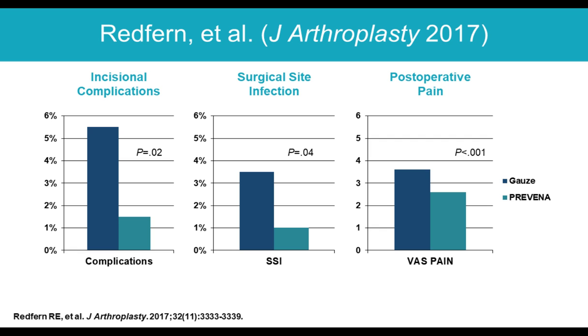And they weren't exactly sure why this happened. This has been seen in other surgical subspecialties, specifically in patients undergoing cesarean section, having less pain when they had a negative pressure dressing on their incision. But this is thought to be due to the mechanical stabilization effect of these kinds of dressings.